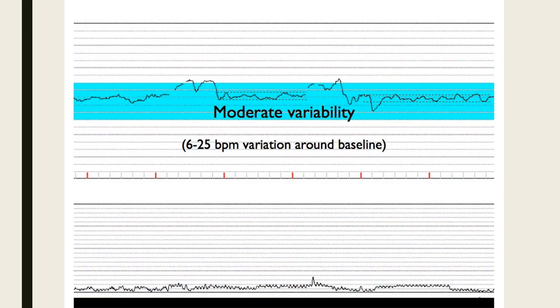Moderate variability is six to 25 beats per minute — this is where we want to be, the gold standard. We know baby is well oxygenated, and it's a reassuring sign. We check moderate variability in between any periodic changes. In between these big accelerations happening here, we want to determine what our baseline is by looking past the accelerations, cutting those out for a second, and then we can determine our baseline for the rest of the 10-minute strip.